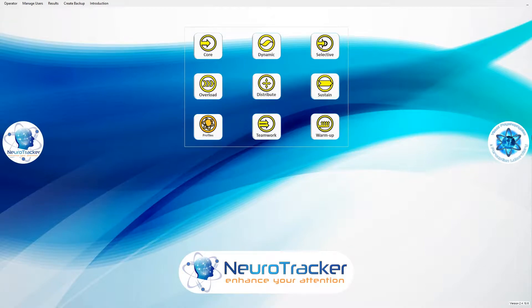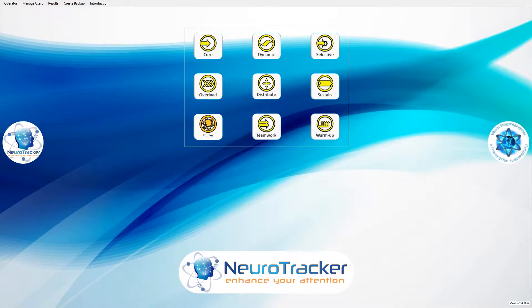First, start the Neurotracker program and log in with your username and password. When you see the home screen, you're ready to add a user.